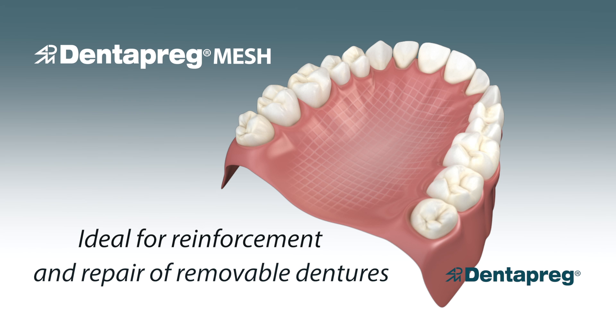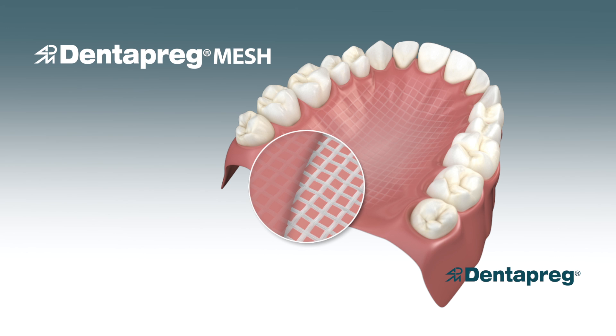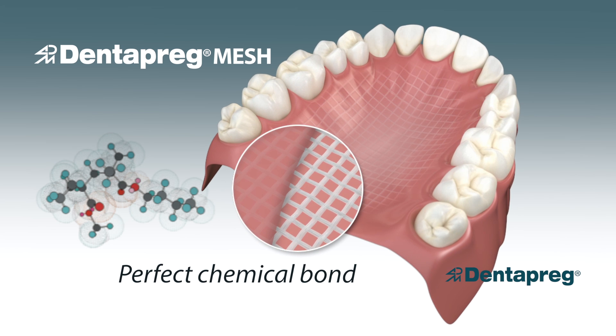It is made from high-end glass fibers impregnated with heat-curing resin that chemically bonds directly to the acrylic denture.